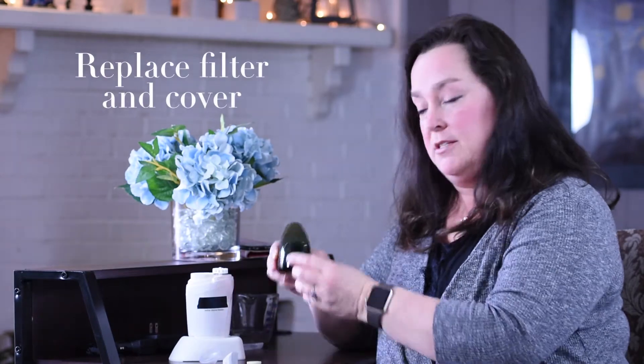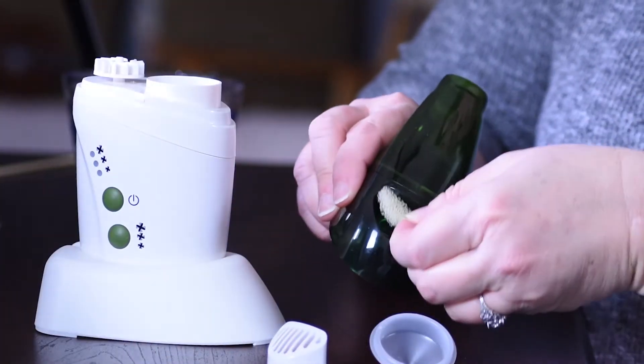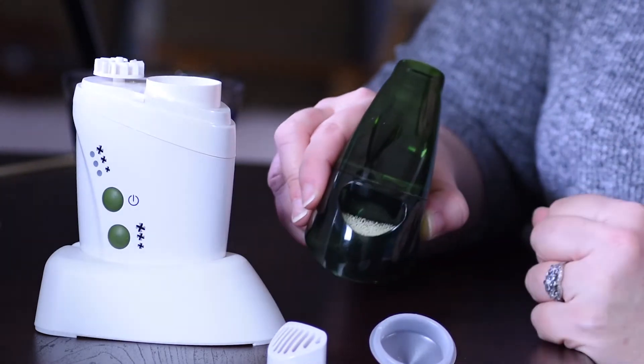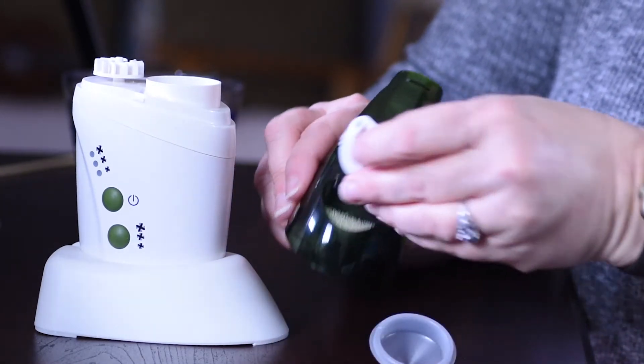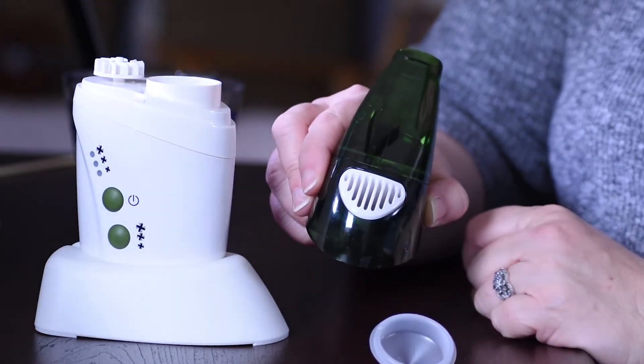Next, you want to replace the filter and the filter cover on top of the mouthpiece. The filter fits right into this little slot, like so, and the filter cover just slides right in and keeps the filter secure.